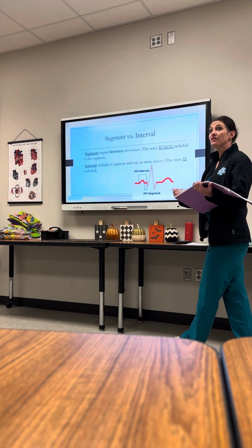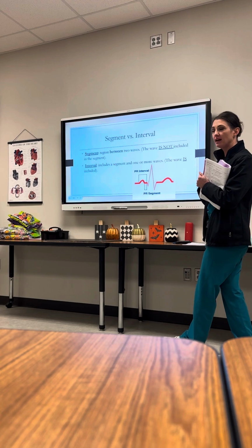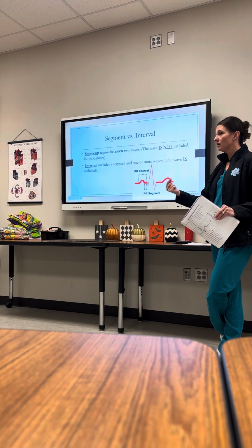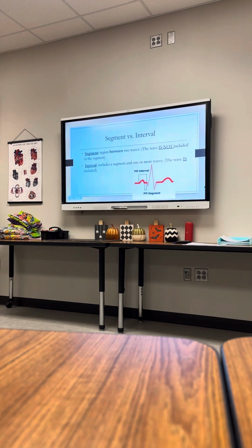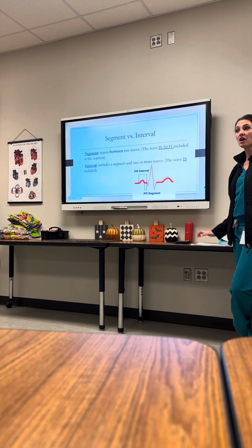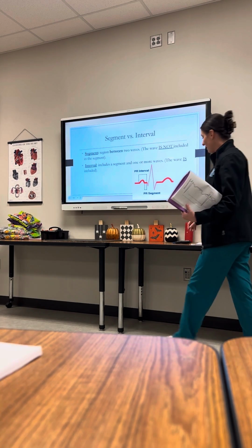I want you to turn the page to 51. And at the top of 51, let's define what an interval is, and then we'll come back and talk about our segments. So what's an interval? It includes a segment and one or more waves. So with an interval, the wave is included. Okay, so let's talk about a couple, go back to page 50, and let's talk about a couple of segments, and then we'll come back to intervals.